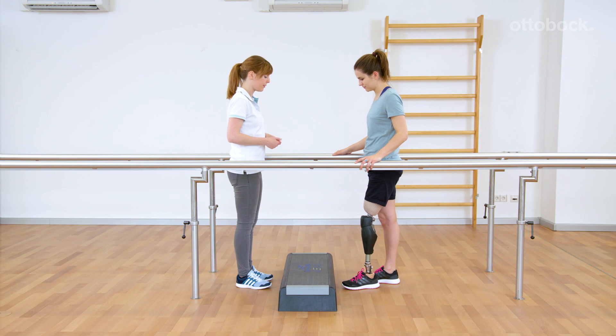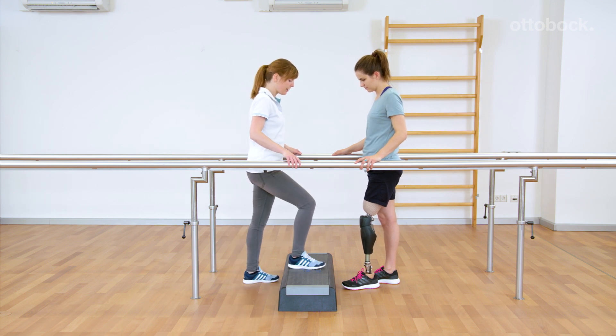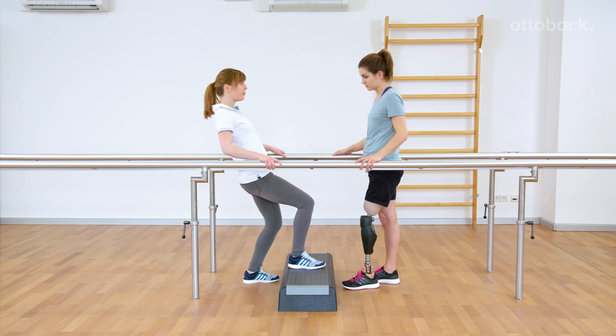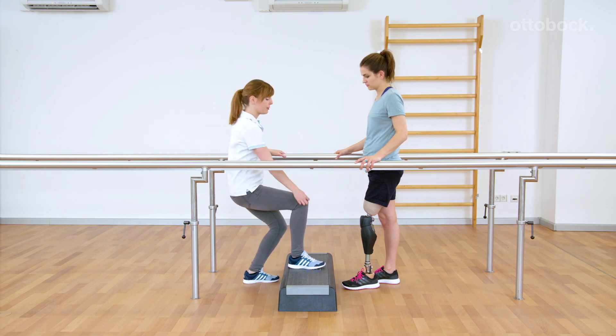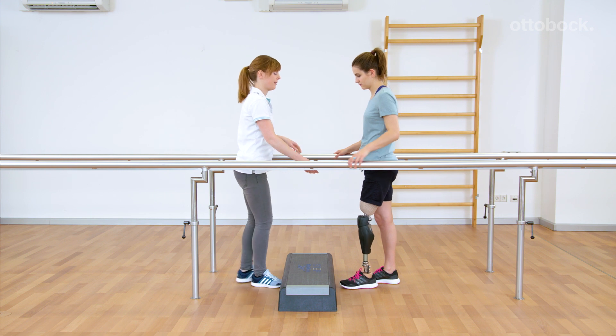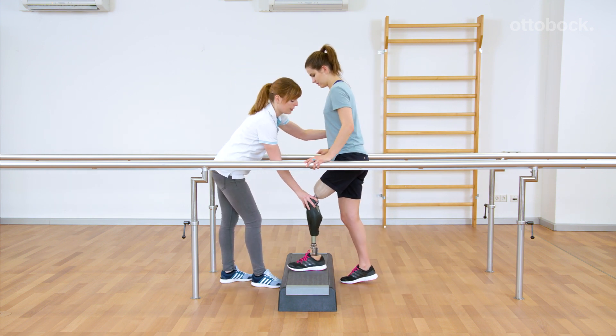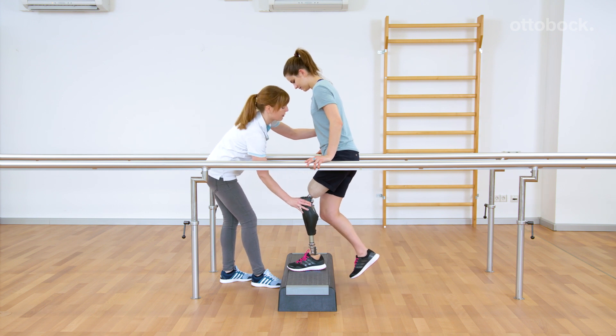The knee joint will unlock and the normal stance flexion resistance will be activated if weight is taken off of the prosthesis, if the foot hits an object during the movement, if the foot is repositioned after stepping onto the stair, or if the lower leg rotates backwards.